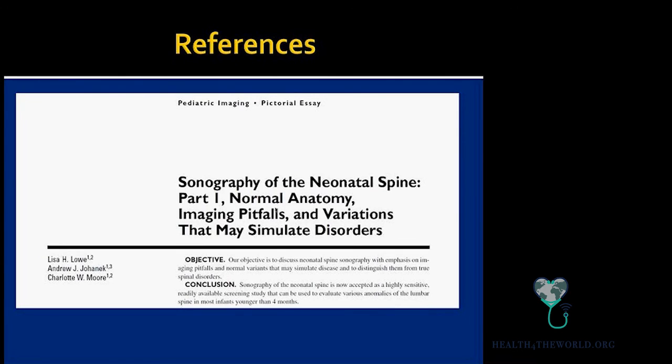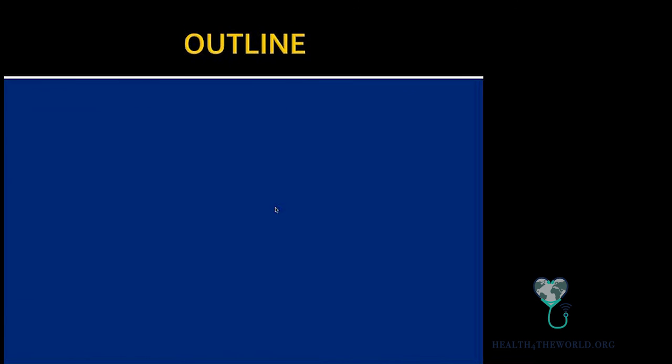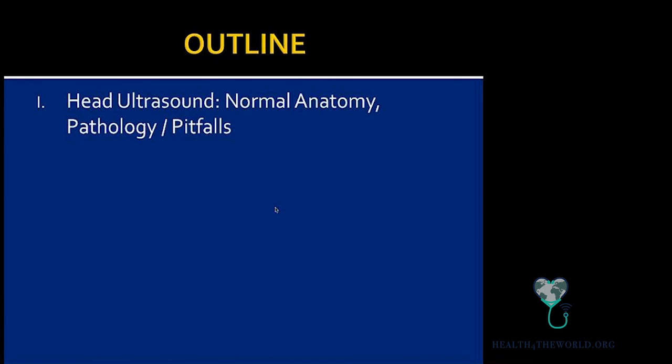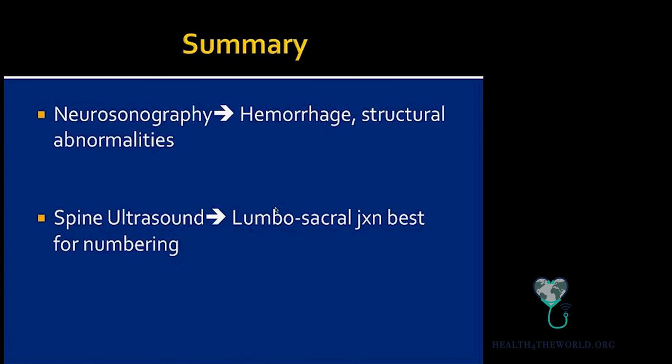All right, a nice reference is Sonography of the Neonatal Spine. There's both a part 1 and a part 2 that is really helpful. All right, so we've talked about ultrasound and pathology. We've talked about spine ultrasound, normal anatomy, and cases, and that's about it.